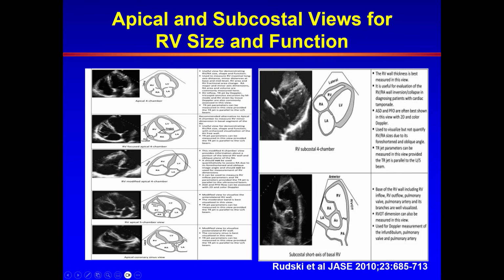That's a view that brings in the coronary sinus. It is a modified view from the focused view that we just described. It can help you look at flows from the sinus into the RA, as well as the tricuspid valve and all of the other things. It can be at times more challenging to obtain.